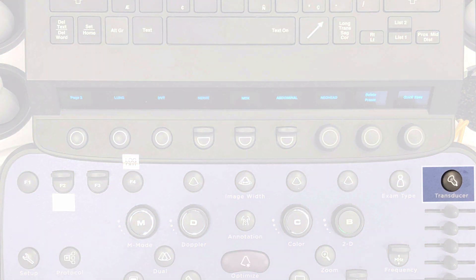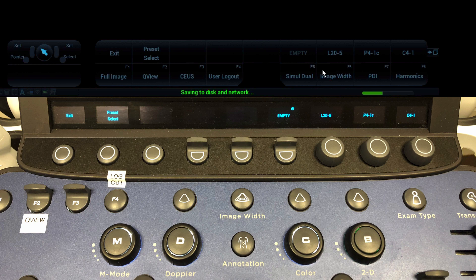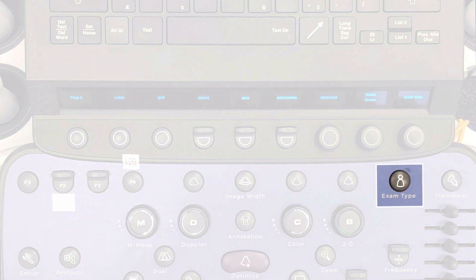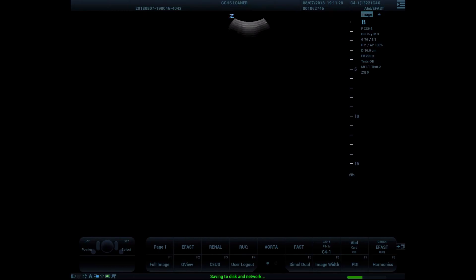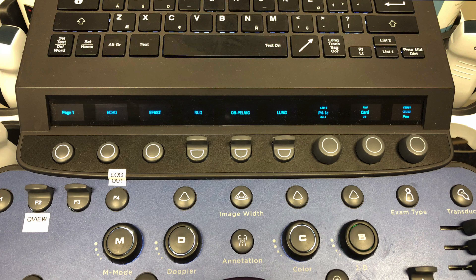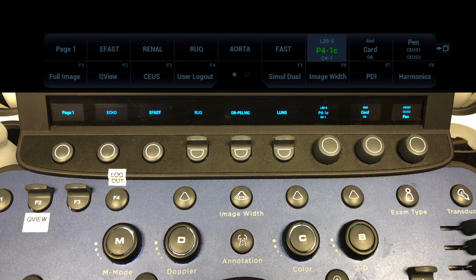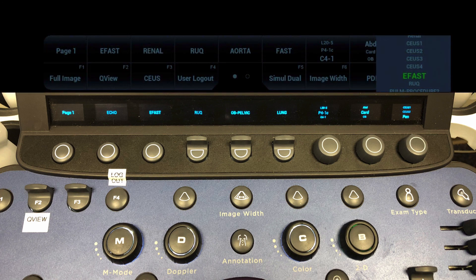Select the probe by pressing the transducer button. Choose the transducer you want to use by the far right OLED buttons with the transducer name listed on the OLED screen. The probe name is also displayed on the top row of the menu indicators on the screen — remember, these are not actual buttons but display what the OLED and function keys are programmed to do. Now select your preset by clicking the exam type button. The OLED soft keys will display the quick pick list of presets most commonly used for that probe; these quick picks may differ based on your location setup. With the far right OLED soft key dials, you can choose the probe by turning the dial to highlight the desired probe and pressing the button to select. Use the other two dials to pick your preset: the middle dial picks the preset group and the last dial picks the exam preset. Press the button to activate the highlighted option.